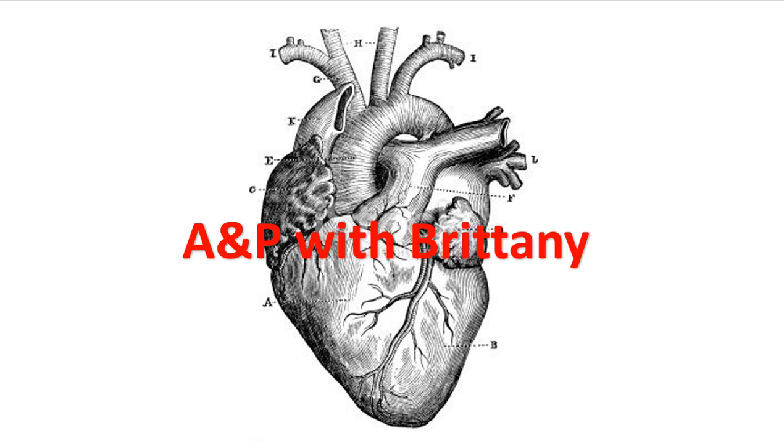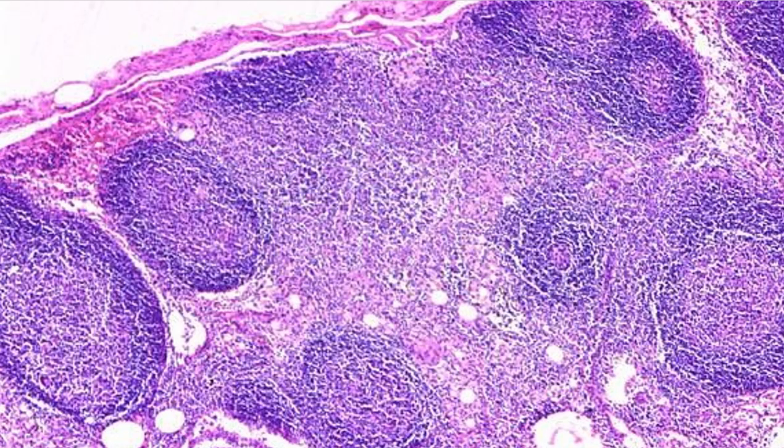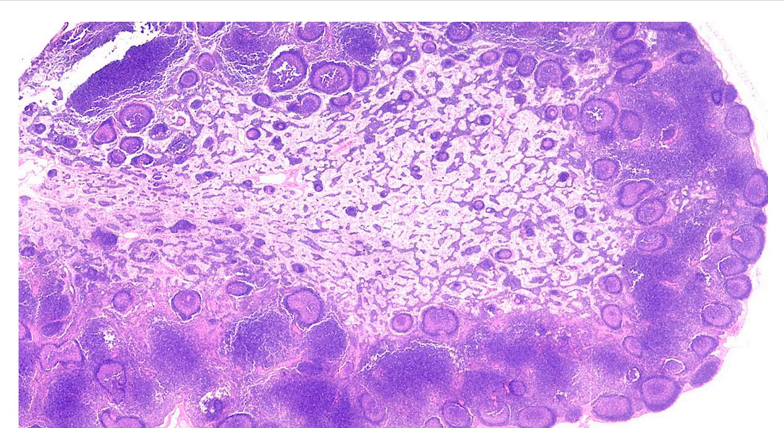Okay, so I've listed here the structures that we're going to be looking for in the lymph node. So we're going to do the lymph node first. Let's start off by just looking at a lymph node. And here's a better picture that's zoomed out to where you can see the full lymph node here.